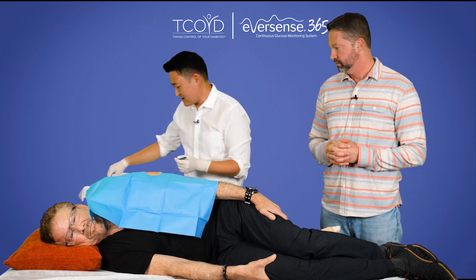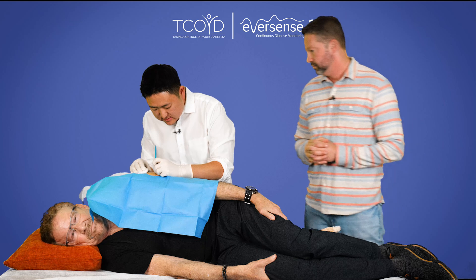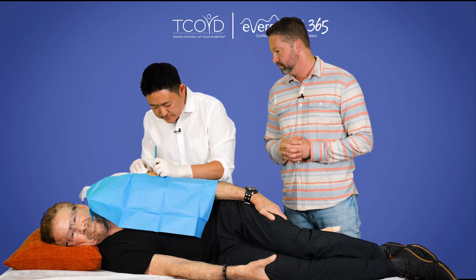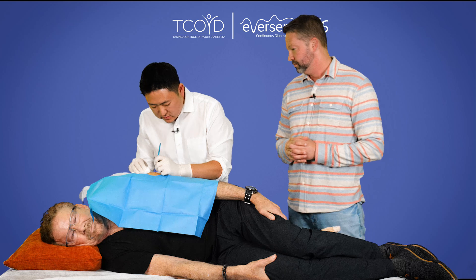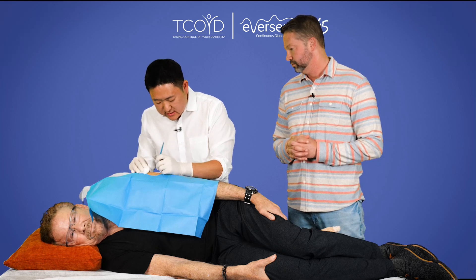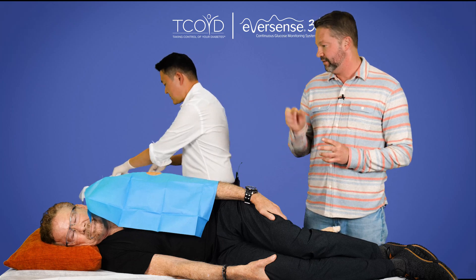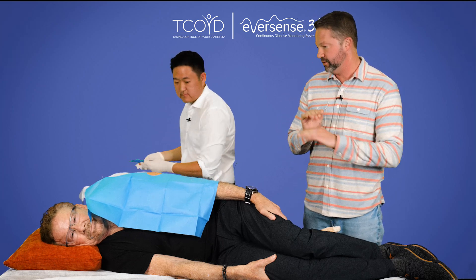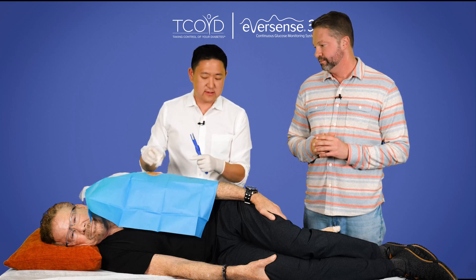All right, let's get started. So we're just making a small five millimeter incision with the scalpel. I like to do one poke kind of in one direction and lengthen the incision ever so slightly by twisting the scalpel around. You're doing this kind of at the end of where the sensor is going to go. Correct. It's like the entry point, and that's marked out using the stencil.